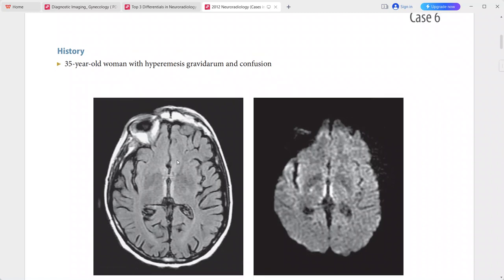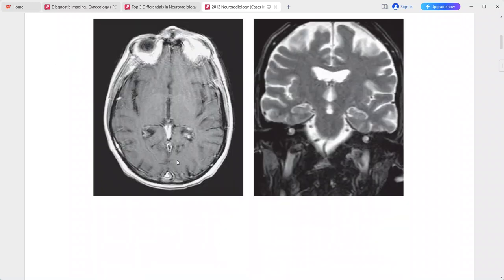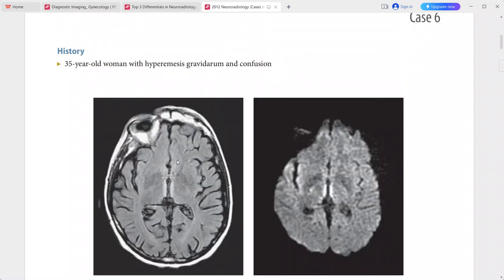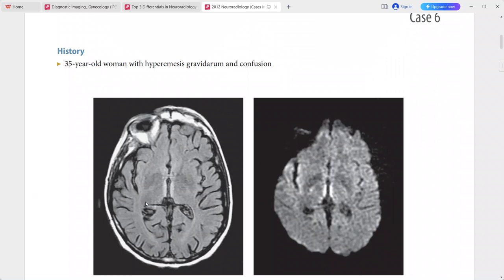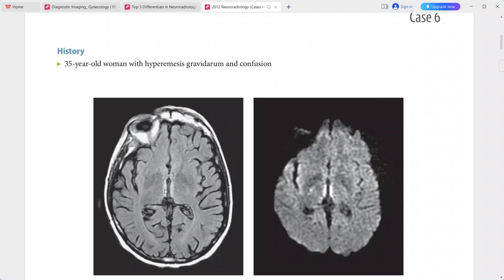Next case: 35-year-old woman with hyperemesis gravidarum and confusion. The FLAIR sequence shows hyperintense signal in the bilateral medial thalami along the walls of the third ventricle.